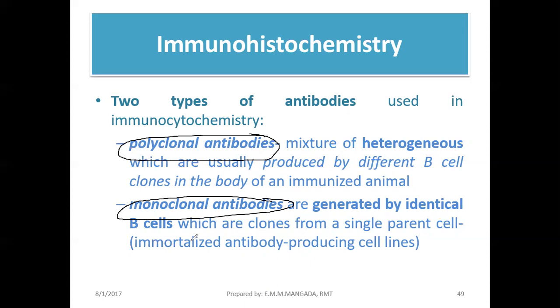Okay? But since nag-iisang epitope lang yung binabind nila dahil sila ay puro pare-pareho or sila ay identical, that makes the test more specific. But for polyclonal, dahil iba-iba silang types ng antibody against different types of epitope, ibig sabihin, kahit saan dun sa antigen, pwede sila mag-bind.